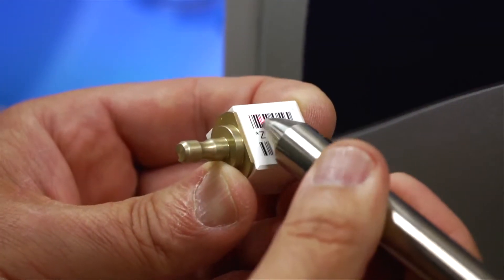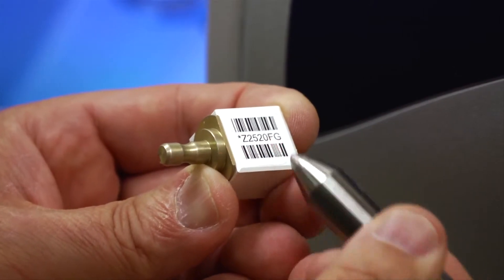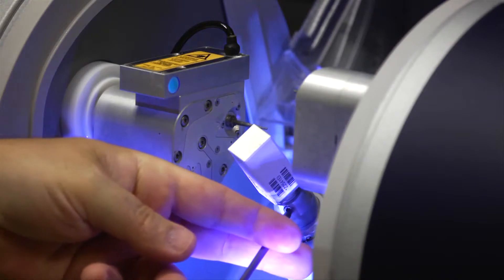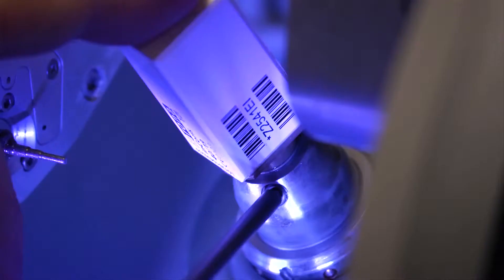Depending on your system configuration, either scan the block with the manual barcode scanner or insert block into the milling unit to use the internal barcode scanner. This will provide the milling unit with shrinkage factor information unique to the block selected.